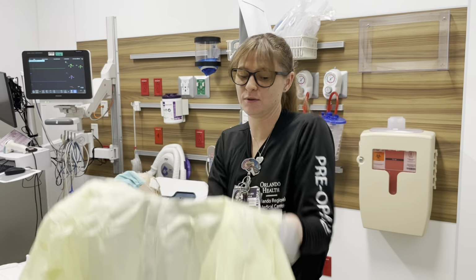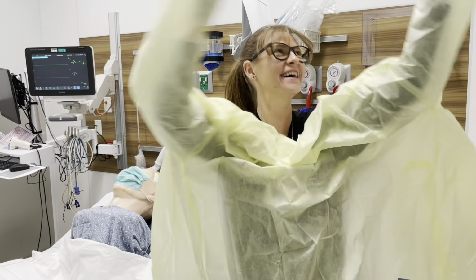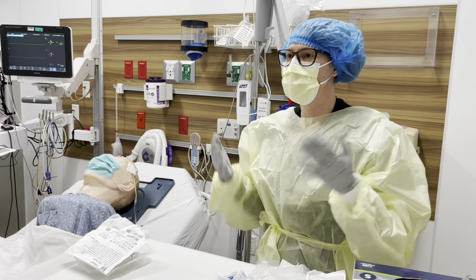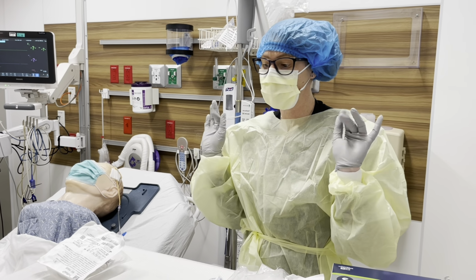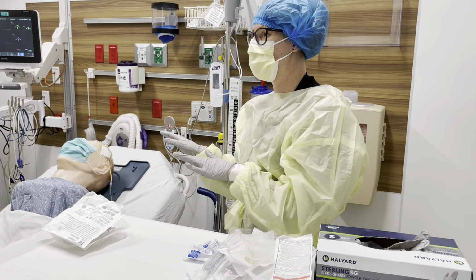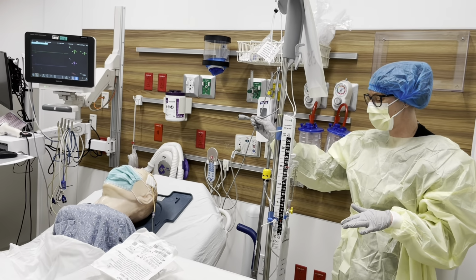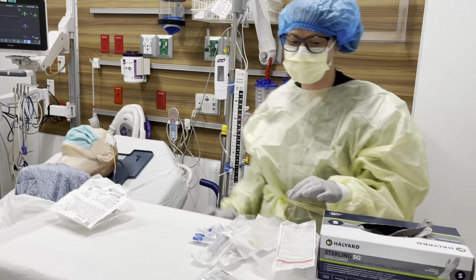All right, now it's time to put your gown on. Gathered all of our equipment. We are all sterile besides our gloves at this point. Our patient is wearing a mask. We also have our transducer ready to go. Once we're ready to hook up, we're gonna start cleaning.